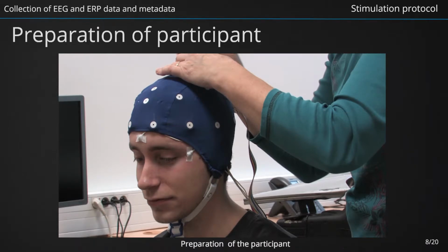Then the participant is familiarized with basic behavioral rules, asked to sit comfortably, pay attention to the stimulation, not to move, and limit his or her eye blinking. Then the experimenter shortly repeats the goal of the experiment and provides other guidance related to the expected brain activities. To increase alertness during ERP experiments, the participants are, for example, instructed to silently count the total number of target stimuli presented on the monitor. When the participant assures the experimenters that he or she understands all the circumstances of the experiment, the soundproof cabin is closed and the experiment is launched.